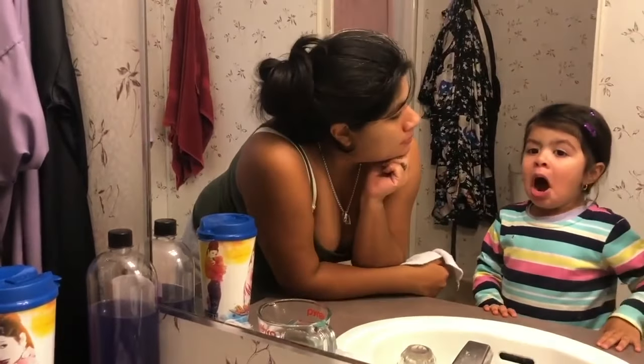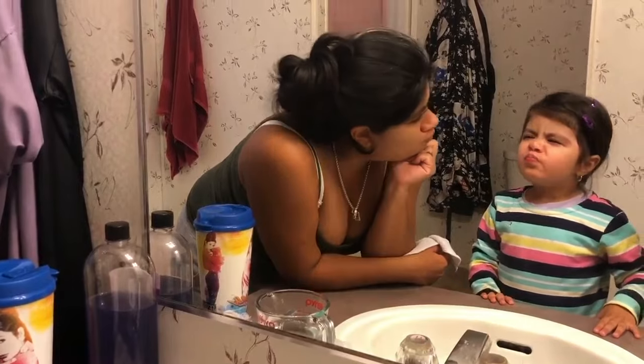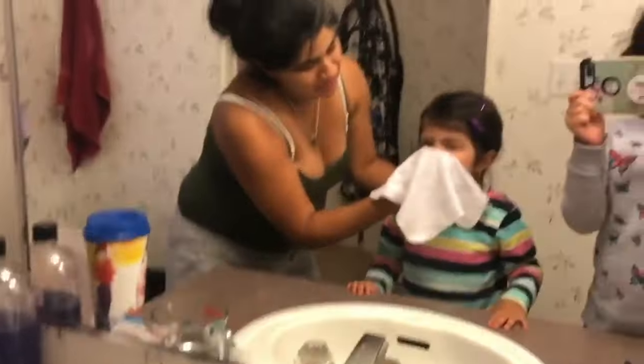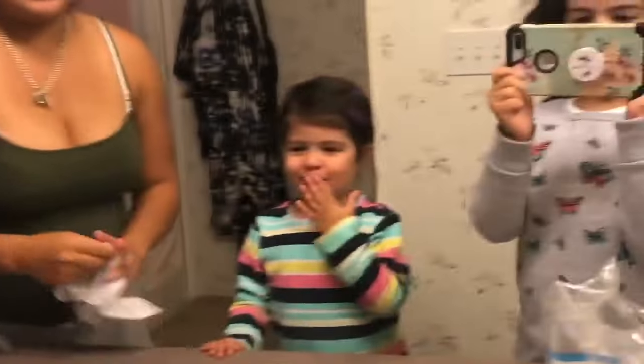Breathe in. Am I supposed to do it like a dragon? Breathe with your nose. Again — breathe in, breathe out. Good job, am I done?